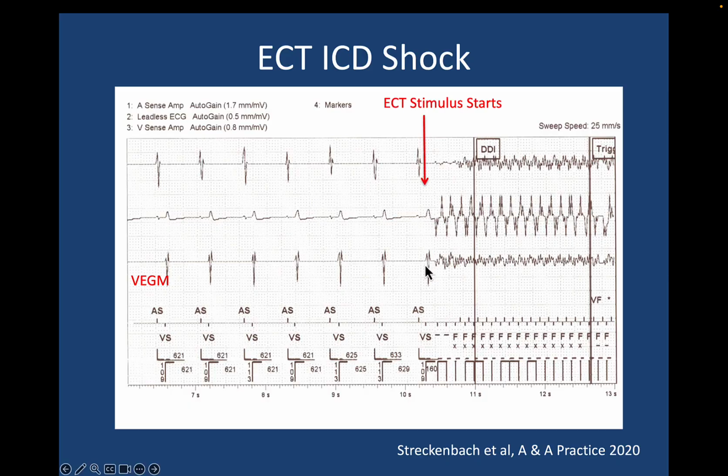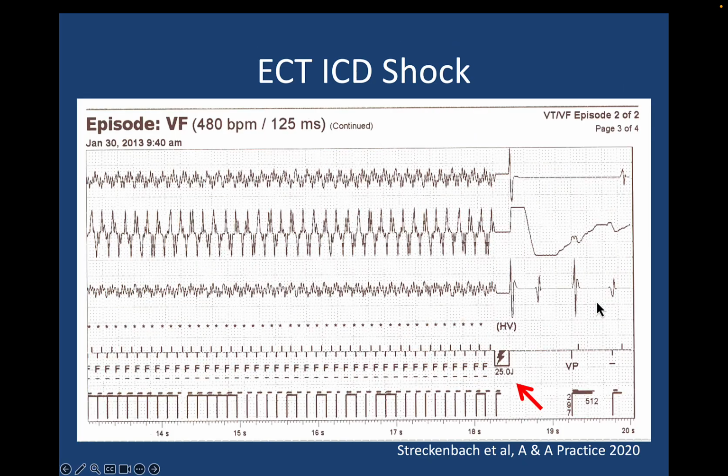The ventricular electrogram senses it. The marker channel quickly detects VF intervals, and within 2 seconds, VF is detected. On the next page, you can see a 25 joule shock is delivered just before the ECT stimulus ends.